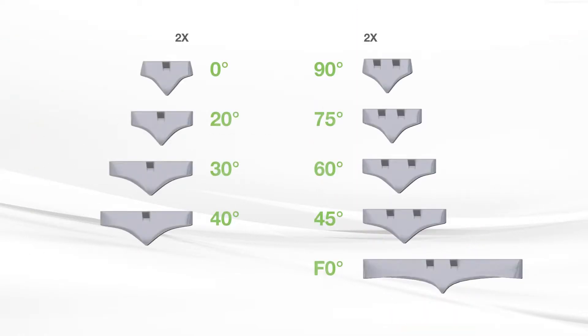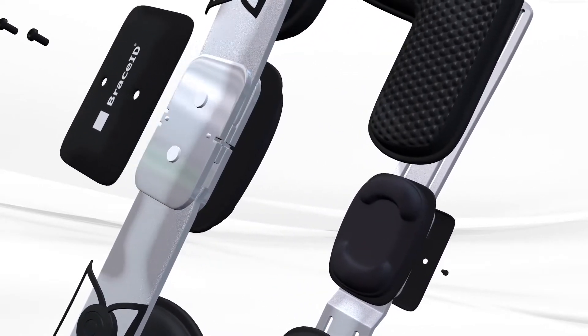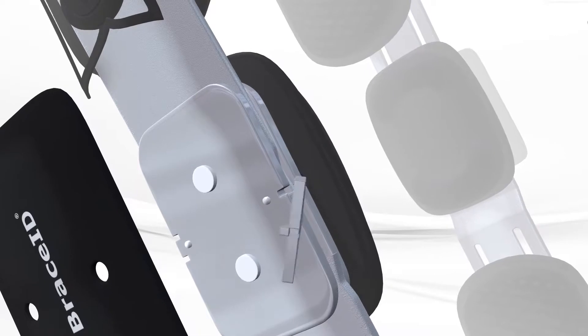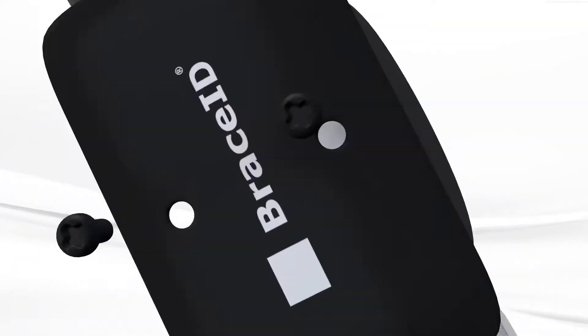Each brace comes with flexion and extension stops to limit the patient's knee movement. To apply them, unscrew the black hinge covers at each side of the brace. Then insert the correct wedges at the front and/or back of each hinge.